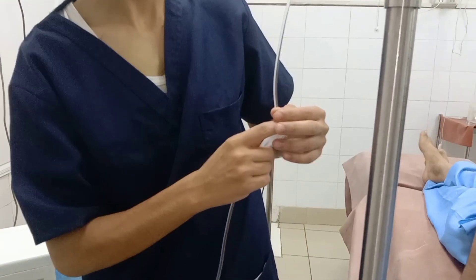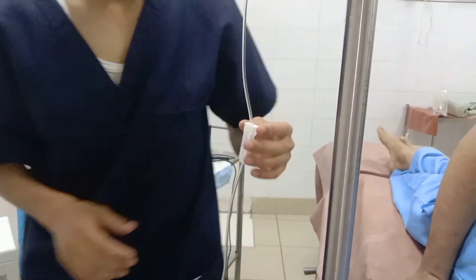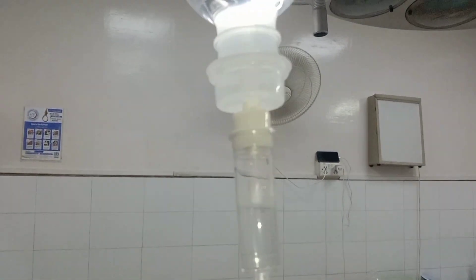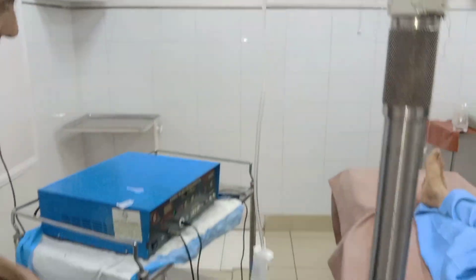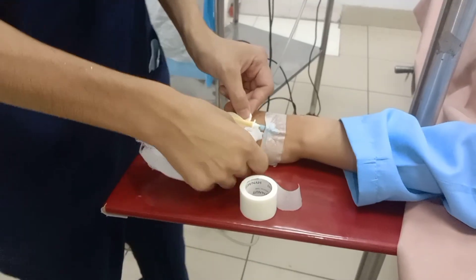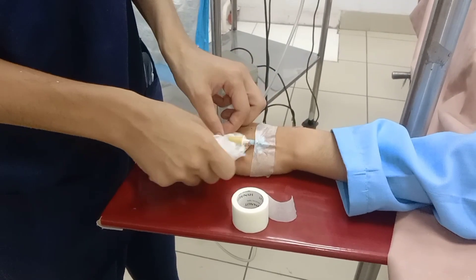All aseptic precautions were observed. The surgical site was shaved if required, cleaned thoroughly with antiseptic solution, and draped with sterile sheets. The surgical instruments and necessary equipment were arranged on the trolley.